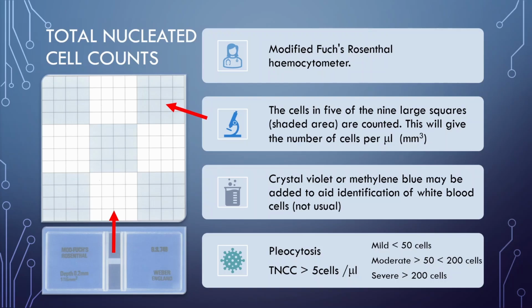because, for example, you may want to know if it is likely that the dog has an inflammatory disease before you do other expensive tests such as MRI. But more importantly, the cells start to degenerate with time, and so getting a quick analysis is very important. And it's quite simple.